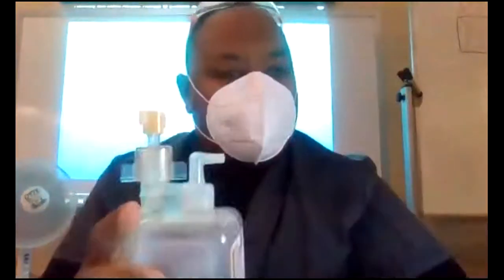Now, what happens is the oxygen travels through here and then goes under here. You see those little striations right there? Those little lines? Those are actually holes on the inside. And so what happens is the oxygen goes through here and comes up and bubbles. The bubbles go up through the water and then out to you, okay? So the bigger this is, the more relative humidity you can have, okay? This happens to be a smaller one.